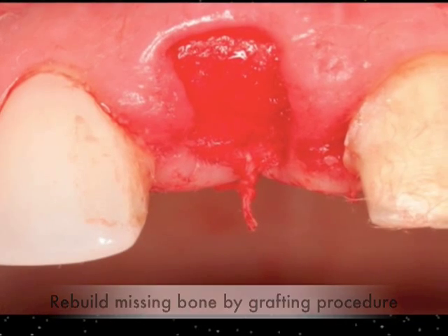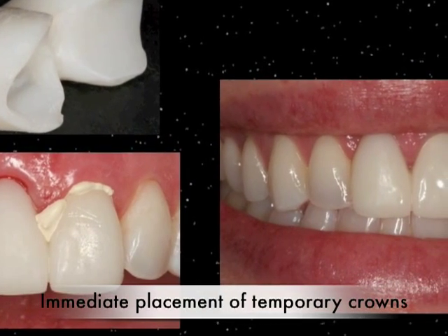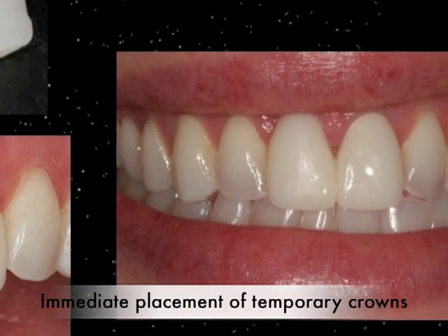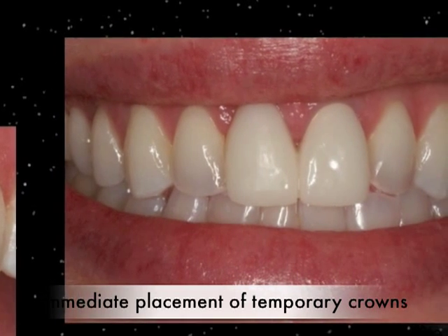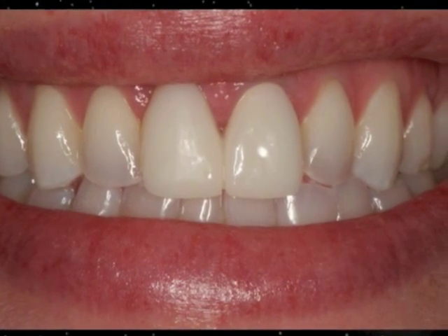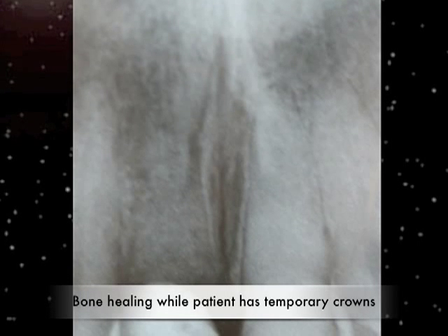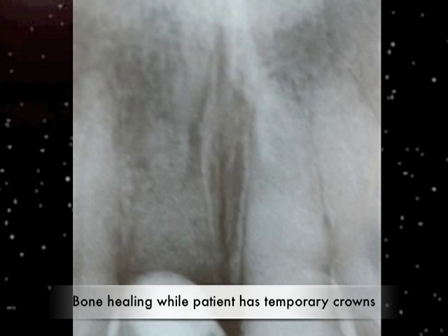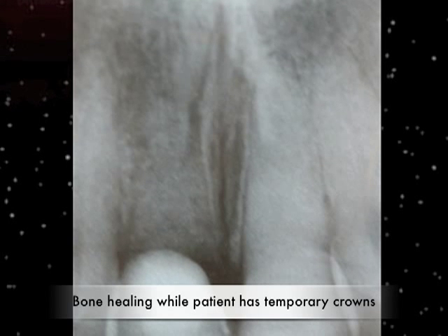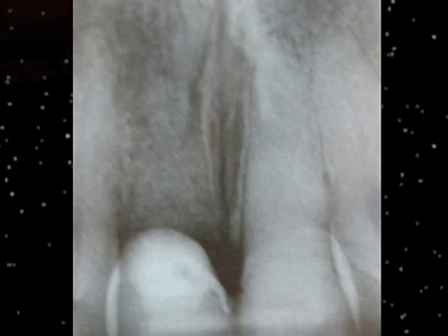And the reason why we had this provisional made or temporary made before the surgical site is so that we can immediately place the temporary into the surgical site and onto the adjacent tooth for support and have an immediate fixed restoration that's quite comfortable and natural looking for her while we allow the bone to graft and grow into the site and allow for eventual implant placement. So one miracle at a time, we put the bone in first and let it heal. We usually need several months of healing for the bone to mature and grow to your own bone to allow us to have a site for an implant placement.